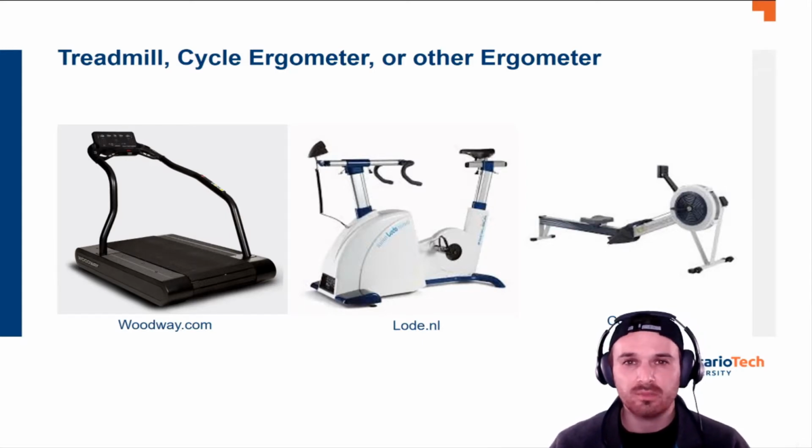So like I said, you're going to need an erg of some kind. Choosing a treadmill versus a bike is obviously going to vary your protocol and how you design it. You also want to make sure that it's specific to the goals that person wants to achieve, or typically their training history. If a person is a runner and they only have running goals, testing them on a cycle erg would probably fry their legs, and you'd really undershoot their potential VO2, especially because that normative data is probably comparing back to cyclists. So because you're not actually using their measured gas exchange, it's all the more important to choose the right test.